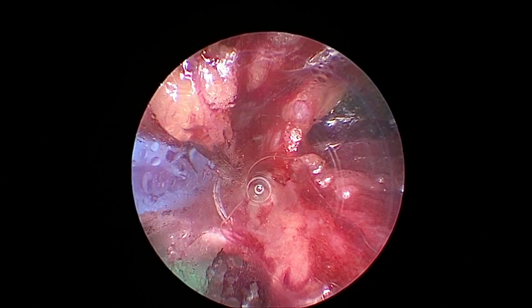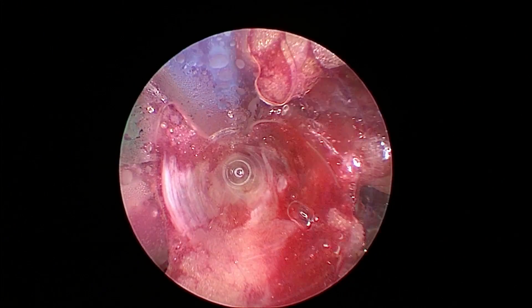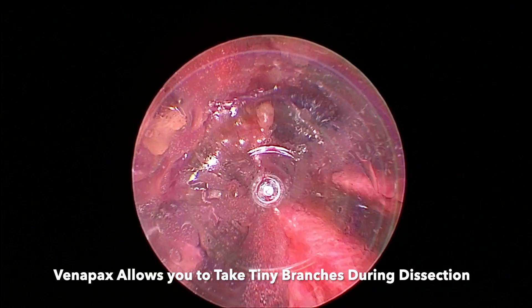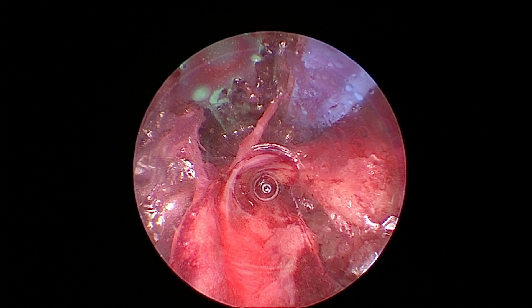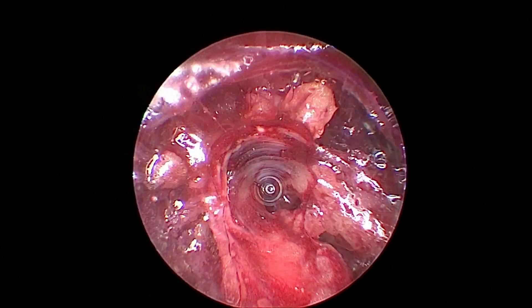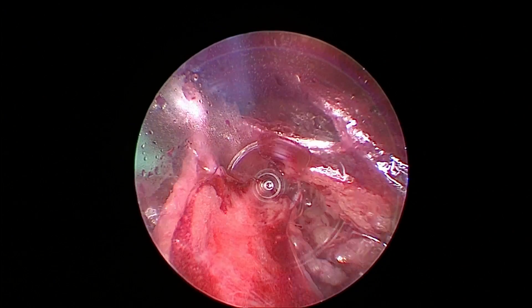You can see I have a nice pedicle now. I'm leaving the vein paired with the artery intact and I'm well off the radial artery when doing my dissection and branch taking. Here's a tiny branch — this is why I like this device, being able to take the branches as I go. I don't have to push past that. I just make a little window, cauterize and cut that tiny branch. When you see the fascia, back up and start to work laterally again — that'll help you open it up and then you can take the fascia. Here's another tiny branch and I'm able to cauterize and cut.